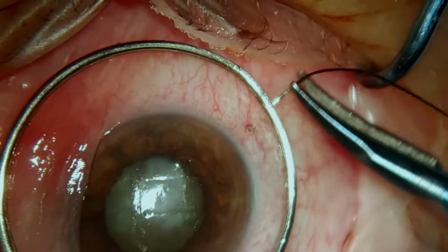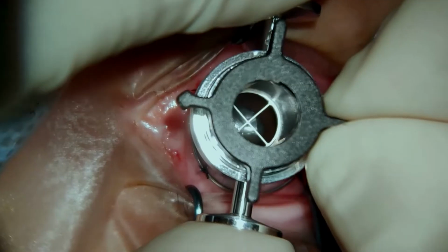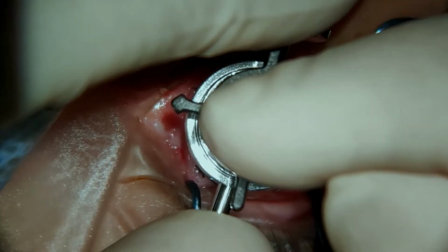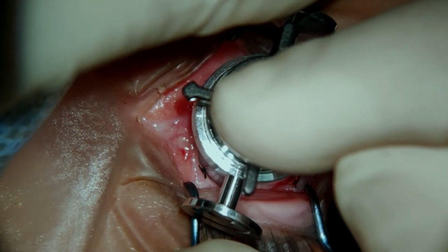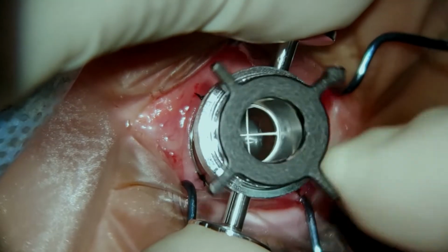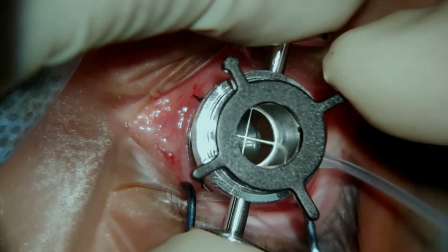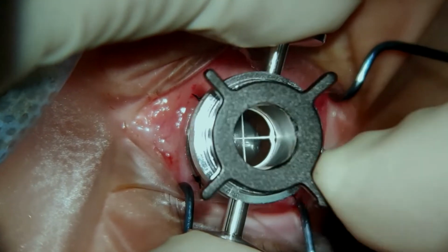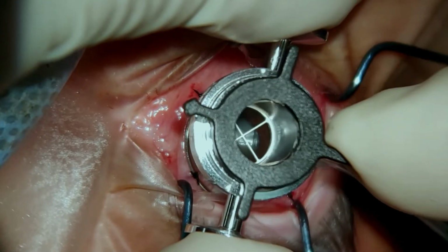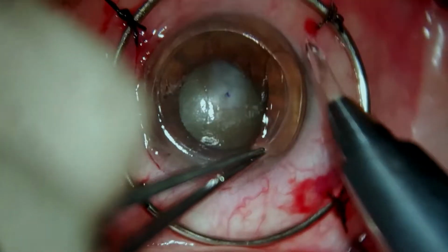Because we're planning on doing an extracapsular cataract extraction open sky, in this case we're mounting a Flieringa ring. We use an 8mm trephine that we've preset. We apply suction, we wait for the suction to engage, then we start rotating the spokes, first until we get the trephine back to the epithelial plane, and then for about 2 full turns, which equal 500 microns depth of the trephination site. We sometimes perforate, sometimes not. In this case we didn't.